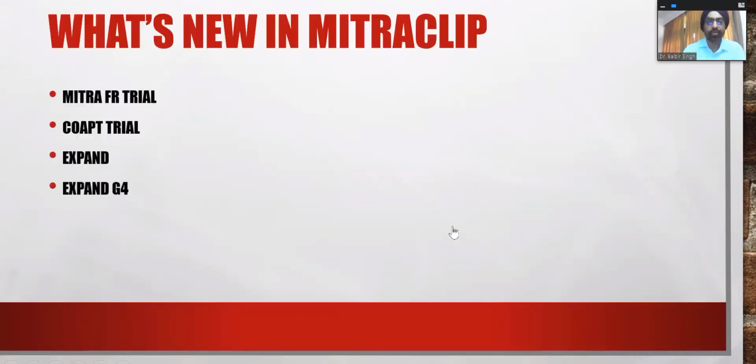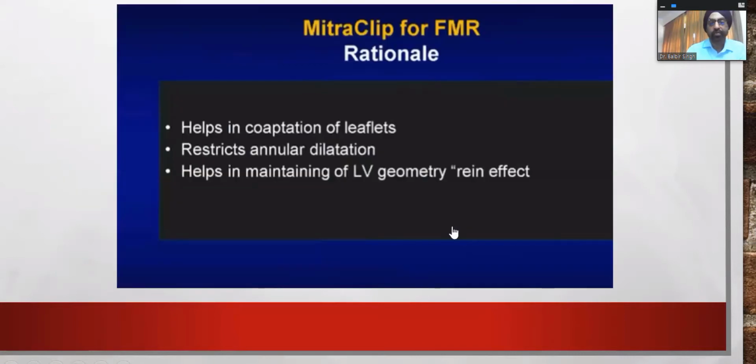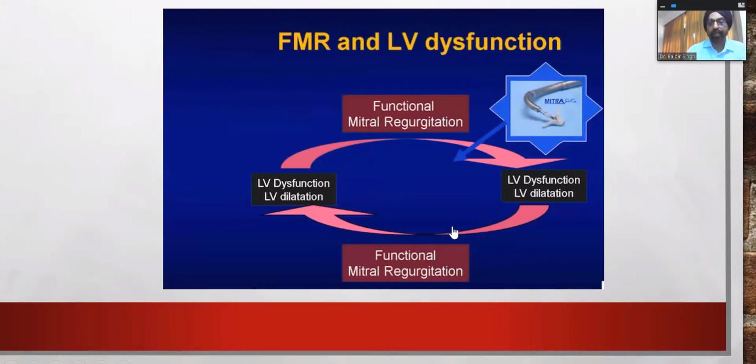So what is new in MitraClip? The MITRA-FR trial, COAPT trial, EXPAND G4. So briefly, I'll discuss that in the interest of time. So MitraClip helps to coapt the leaflets, restrict annular dilatation, helps reverse the remodeling, and is a great tool to improve symptomatically these patients.